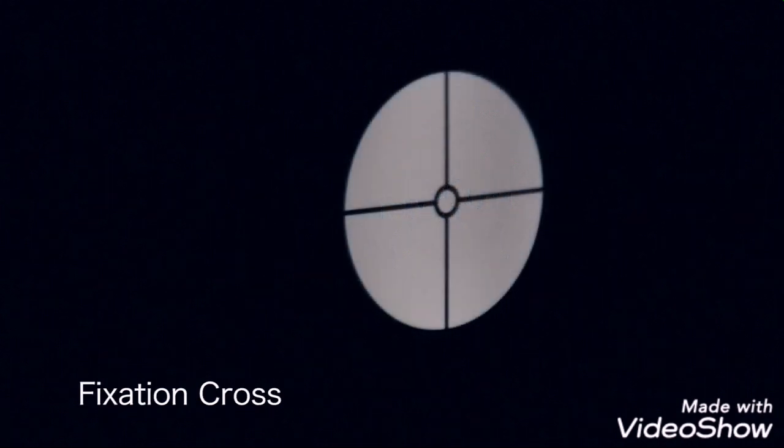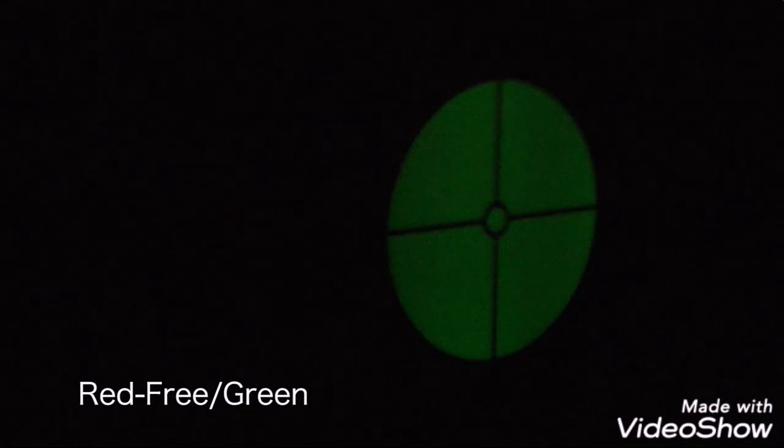Fixation cross projects a graticule onto the retina for assessment of the degree and direction of eccentric fixation. Red-free or green filter is used to examine blood vessels in fine detail. Cobalt blue is used with fluorescein dye to detect corneal scars and abrasions.